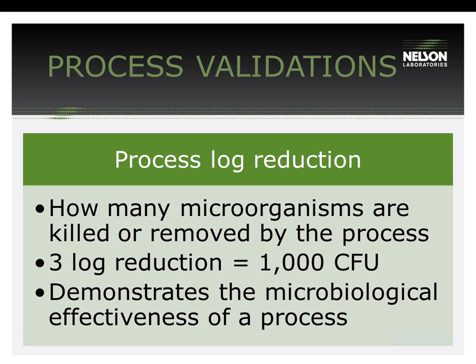And one thing I do not have on the slide here but want to point out is that I need to make it very clear that a 3-log reduction does not equal a 10 to the minus 3 sterility assurance level. The concepts are related, but the numbers are not the same. The log reduction tells you what the process is capable of, and the sterility assurance level, if that is something that you're referring to in your process, is based on both the log reduction capability of the process and the initial bioburden on your tissue.